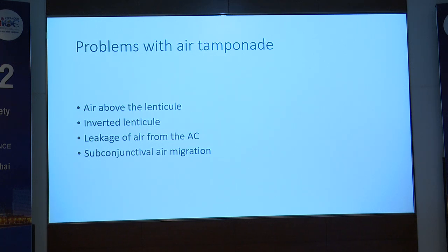Again, it's important that while doing the air injection, you just go below the lenticule. Otherwise, you may end up having air above the lenticule, which may be difficult sometimes to remove. You also have to be very gentle. Otherwise, you may end up dislocating the lenticule. Even sometimes the lenticule may just come out of the eye.